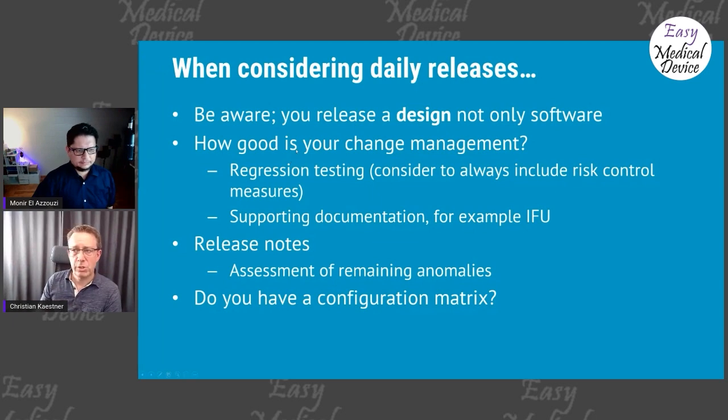How good is your change management? Regression testing is key. If you have any plans at all, and also when talking about MDR, to release a design and you haven't tested everything, you better come up with a very good explanation why regression testing is solid and good enough. And here I always recommend people to always include risk control measures, because you can argue about a lot of things, but trying to start arguing why risk control measures are still valid, personally, I prefer just to run the test again. It's easier than writing a rationale for that.